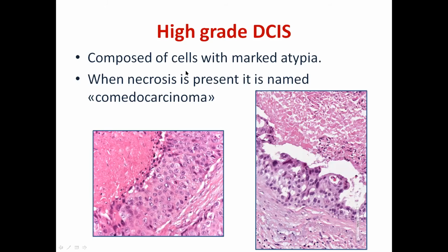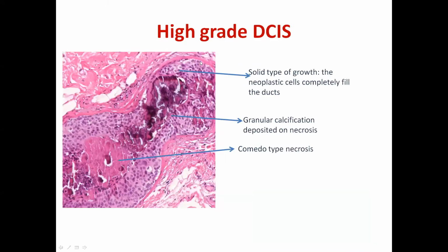This is an example. You see, we have the neoplastic cells, they grow in a solid way, and don't make any glandular structure. They just grow. They're very aggressive. They grow massively, and they grow very fast. They don't have blood support, so they go to necrosis.